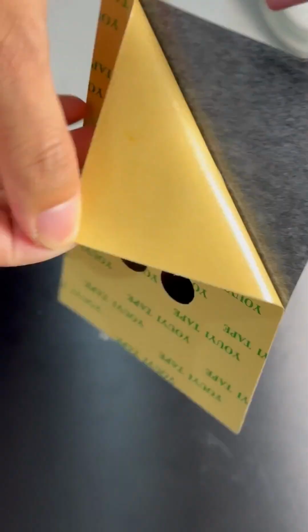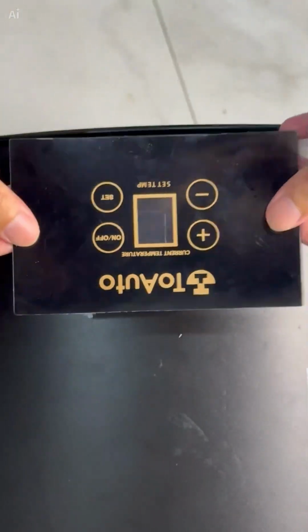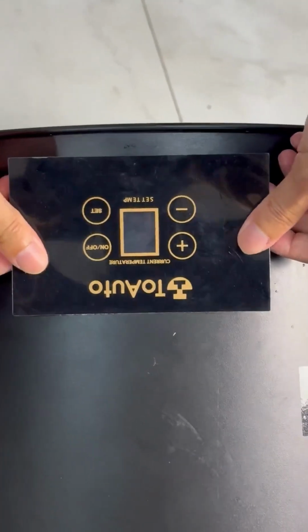Now I will peel off this backing adhesive. Okay, now I'm going to attach it based on the perpendicular relationship between this transparent window and the screen.